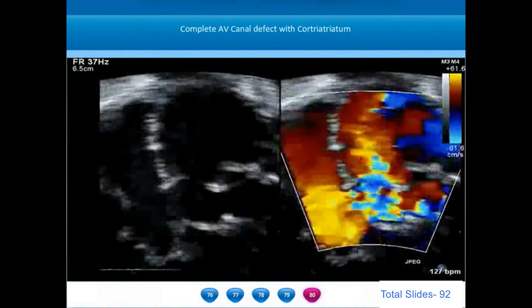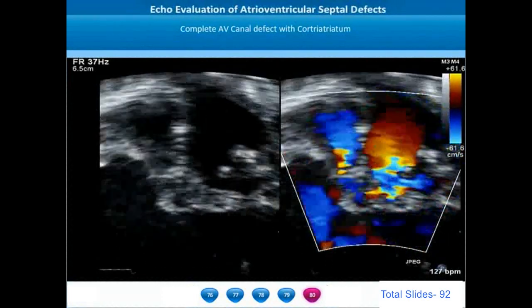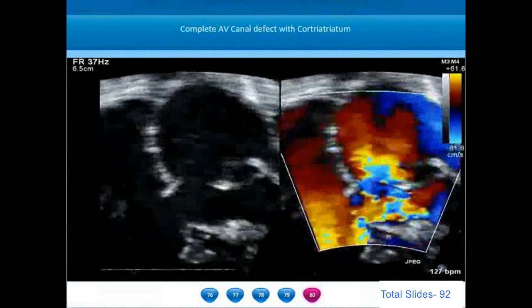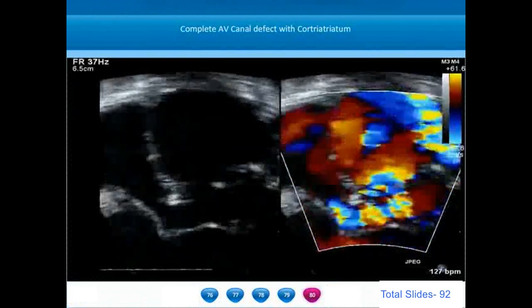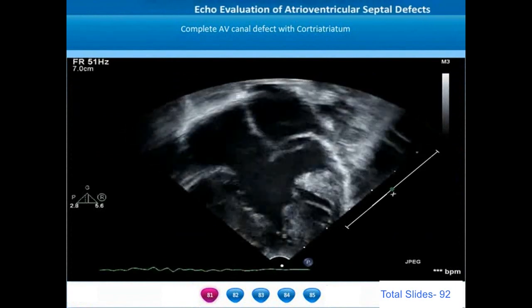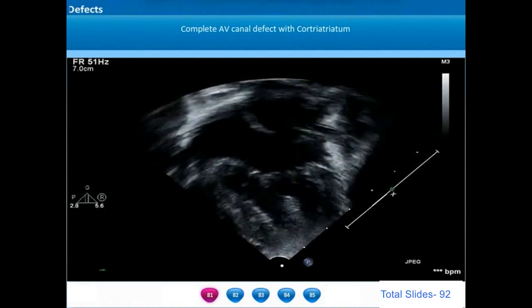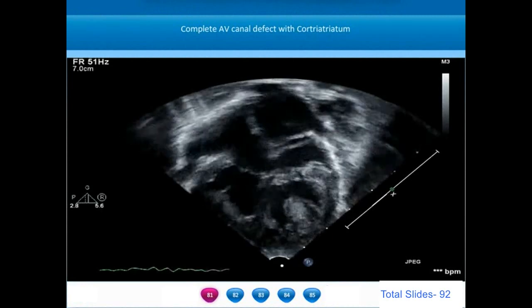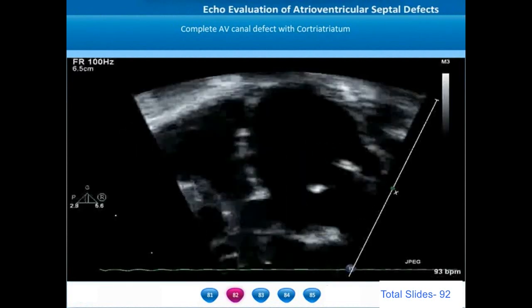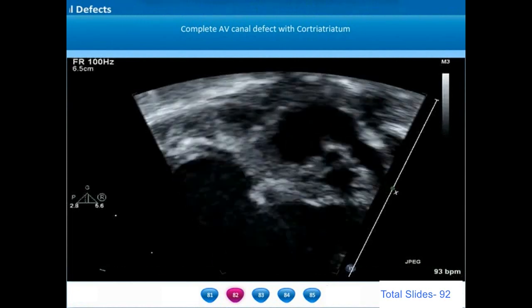Obstructions to left ventricular inflow and outflow can happen in AV septal defects. This is an example of cor triatriatum in a patient with AV septal defect — we notice an obstructive membrane within the left atrium causing flow turbulence in the left ventricular inflow region. On apical four-chamber view, there is a dilated coronary sinus representing persistence of a left superior vena cava. The coronary sinus is fully roofed and in addition there is a cor triatriatum with an obstructive membrane in the middle of the left atrial cavity. Color Doppler interrogation shows turbulence across the cor triatriatum indicating pulmonary venous hypertension.